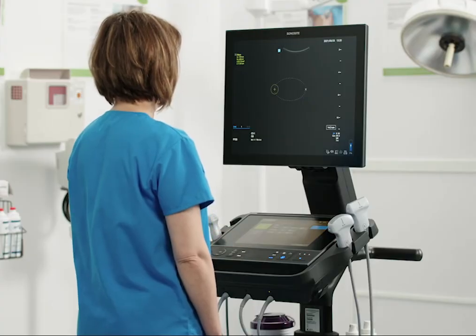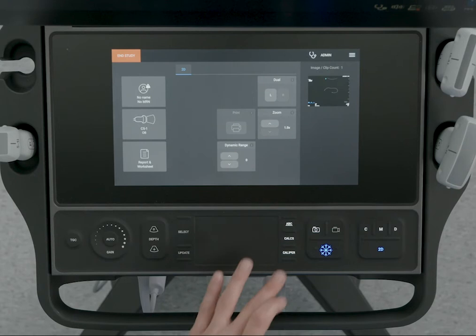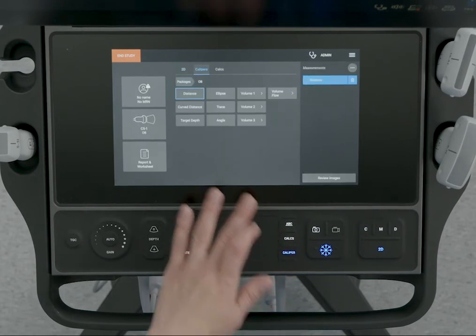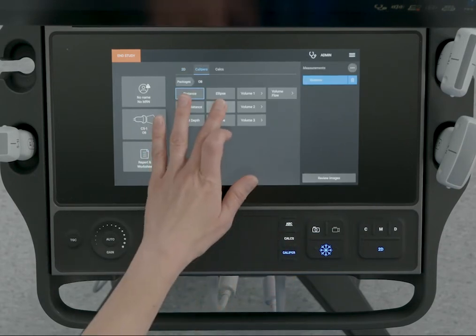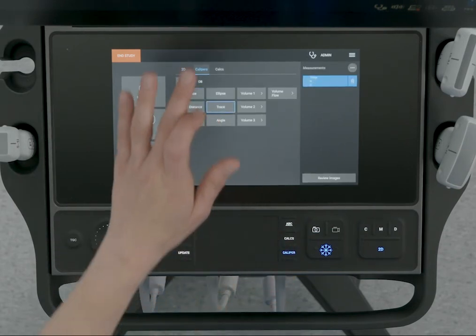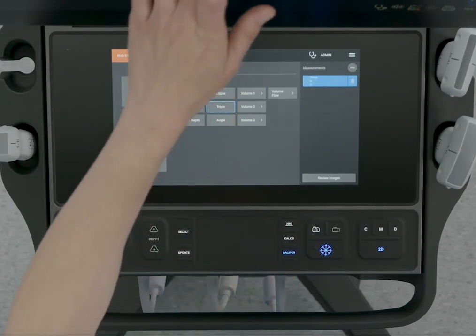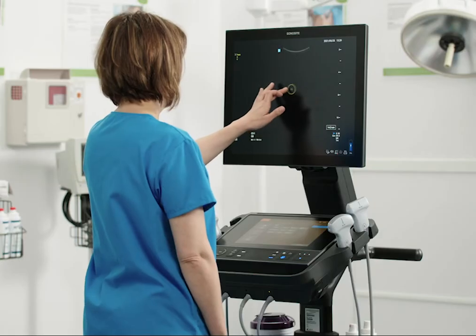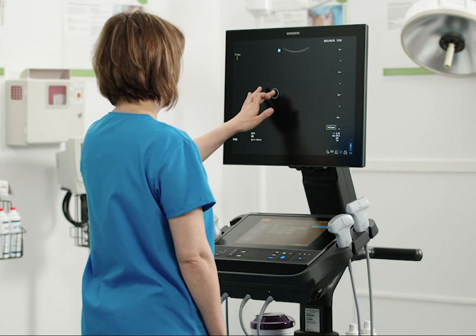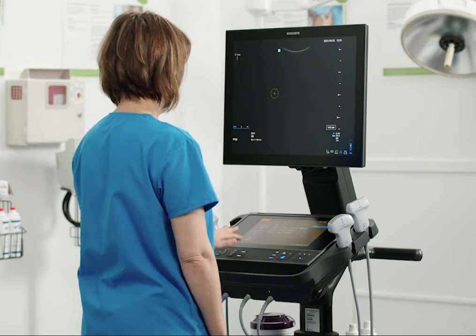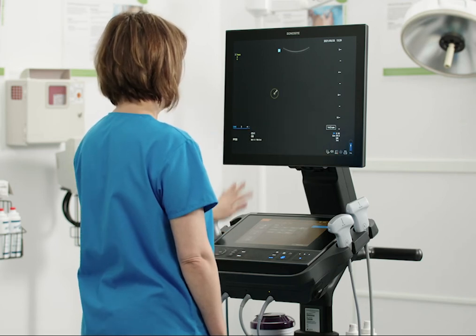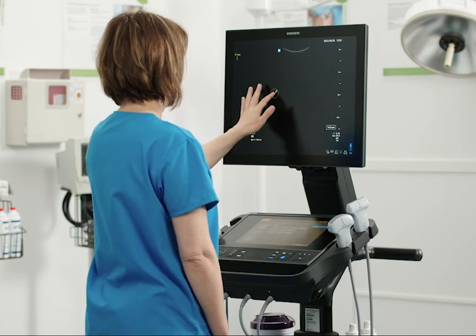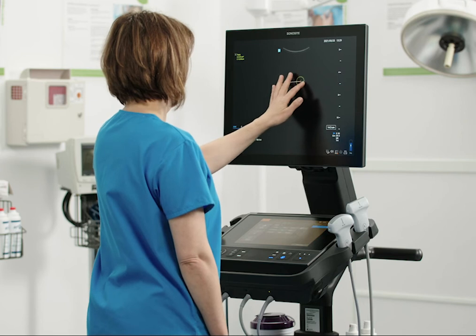If you would like to define your own shape, use the trace caliper. Use the touchpad or monitor touch screen to drag the caliper to your start position. Press select and then drag the caliper where you want to trace.